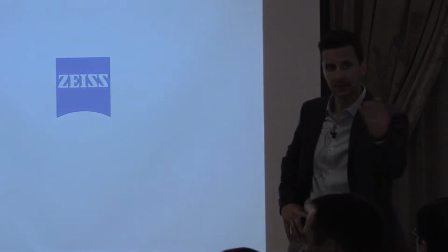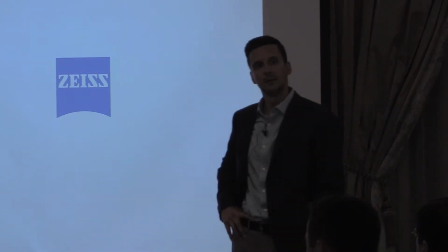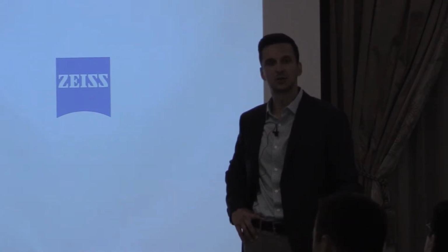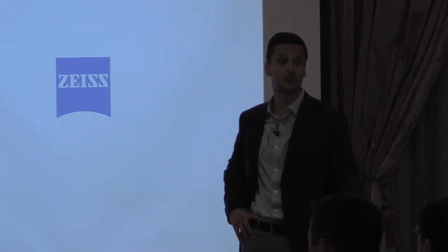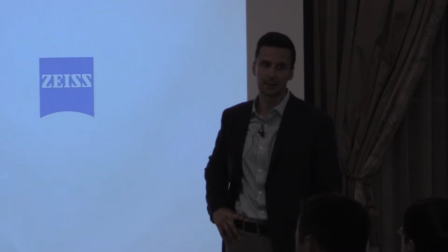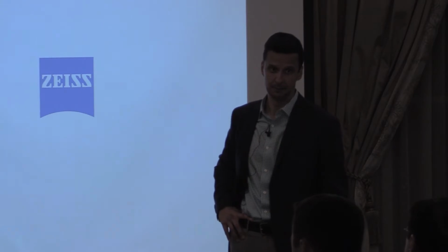For our end-stage glaucoma cases, we're using a lot of 10-2 at this point. We're using it for other things where we're playing with some different nutritional components to see what kind of macular preservation we can get and if we can claw back spots on a 10-2. So that would be really useful, because those patients are long on a 10-2 even at that, and to have a faster algorithm would be useful. But to my knowledge, it hasn't been tested there yet. Maybe it is.